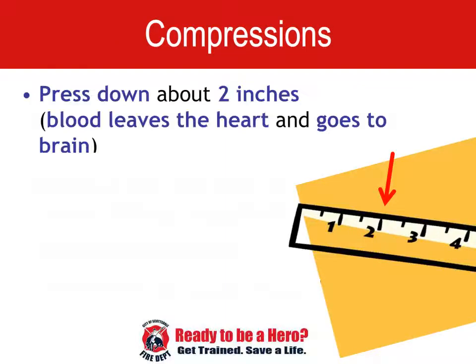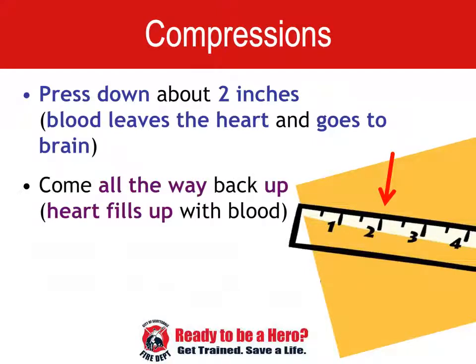You have to push deep, at least 2 inches. We must push on the heart enough to make it move the blood through the body. Remember, we are pushing on the heart, but our goal is to keep the brain alive. This is where bystanders make the biggest mistake. We aren't pushing deep enough.